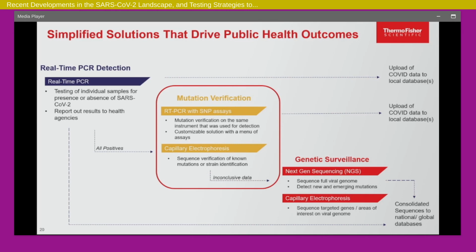This has been an interesting approach by a lot of the public health labs that have to do strain identification: first of all, to ramp up the number of surveillance on number of cases, and use your sequencing when you need it.